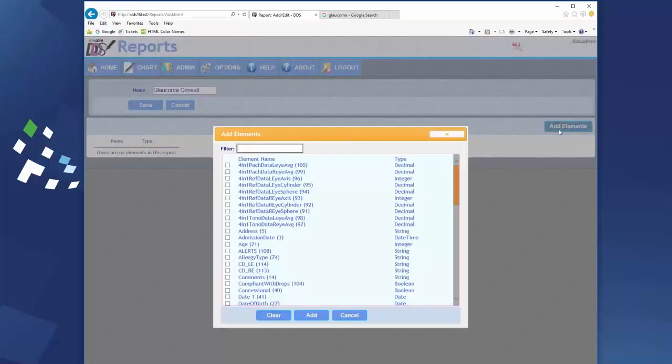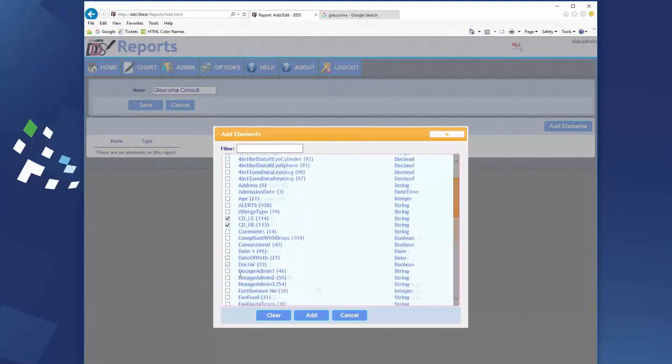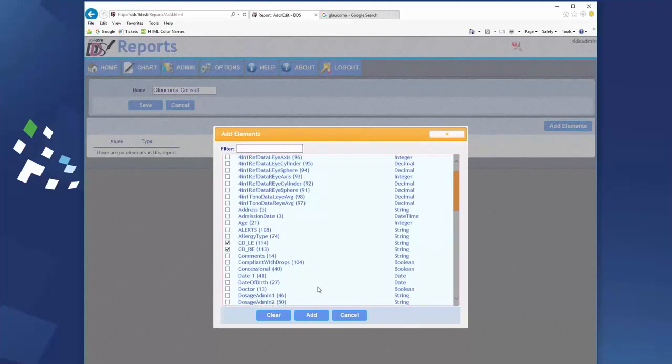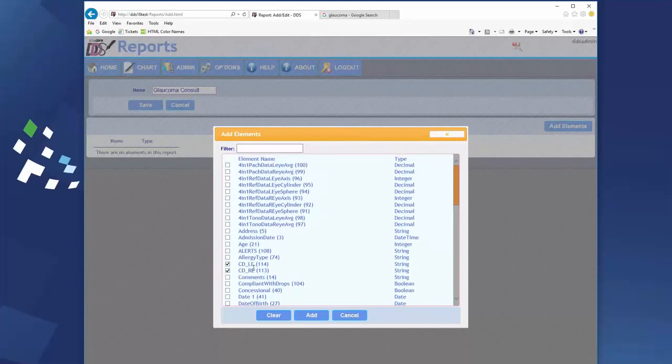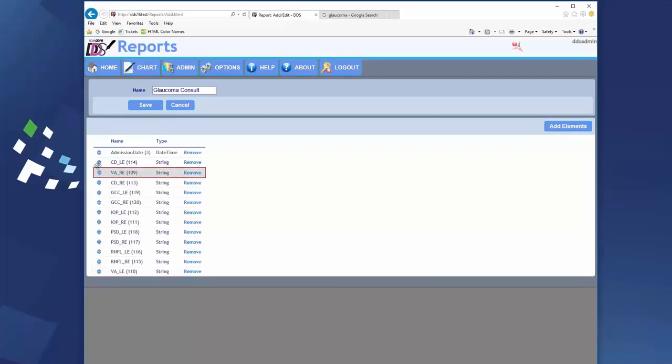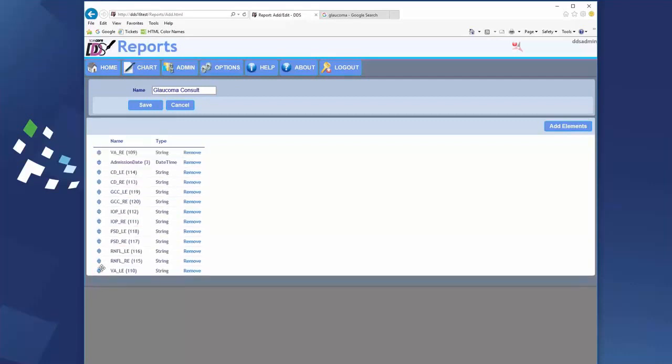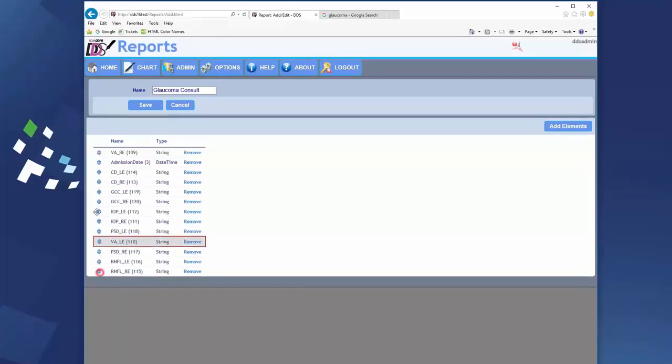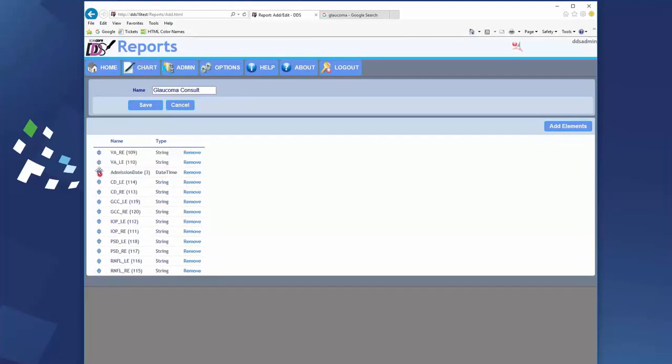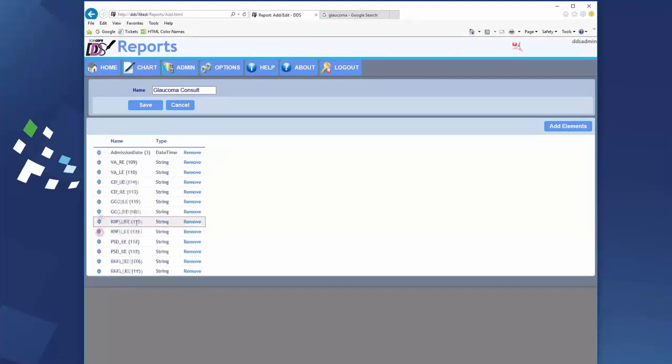The elements that I am choosing are the elements from my glaucoma consult document. I will also select the admission date element. Click add and now we order the elements in a way that means the most to us.